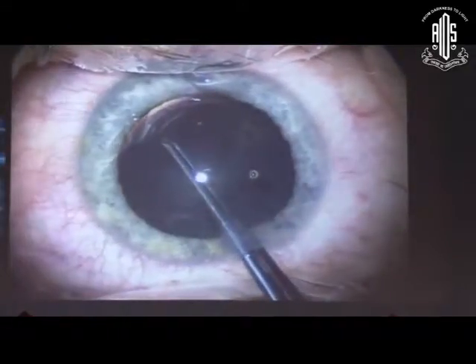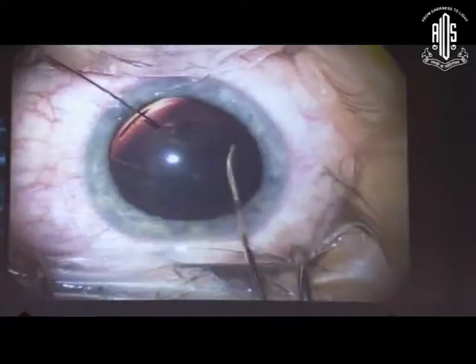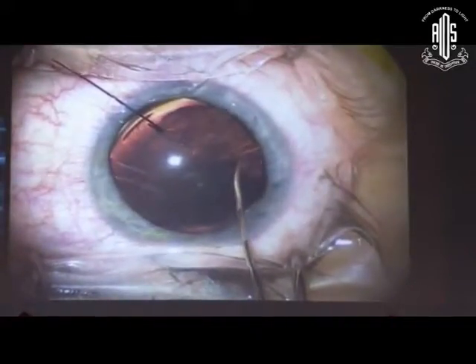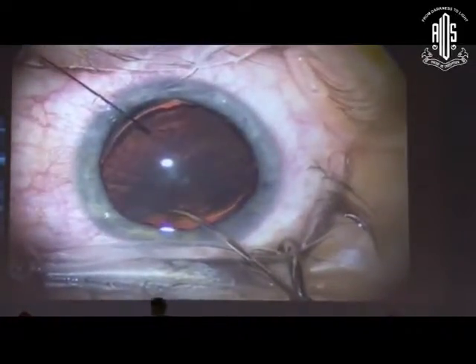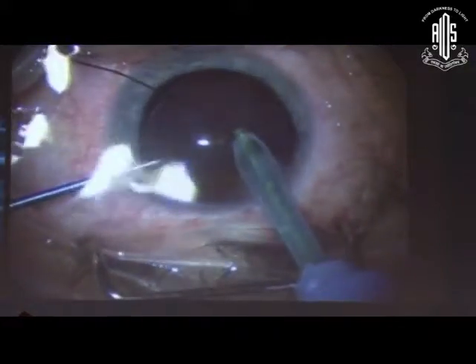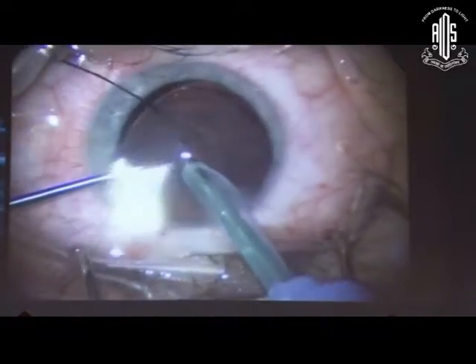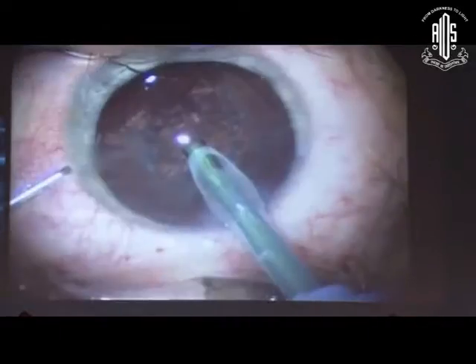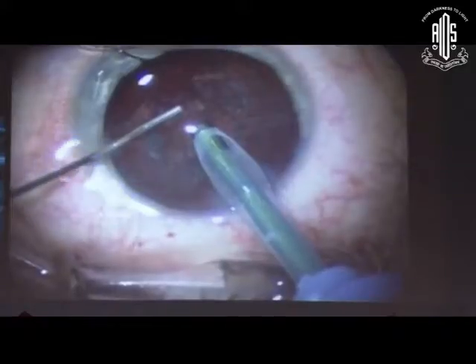The combination of the two devices gives you a graded, stepwise approach. This is a normal, easy, soft case. I'm just doing my rhexis. Just as I go there, I see something's not right — I've probably lost zonule, or maybe the zonule will be there anyway. I decide to proceed. I put an iris hook to support the capsular rhexis, and then I'm doing very gentle rhexis, tiny bits at a time, and I think I'll empty the bag. But as I'm emptying the bag, that zonular dehiscence is increasing.